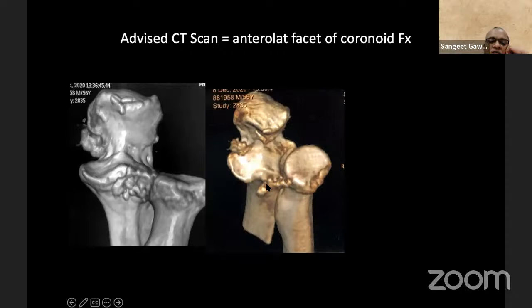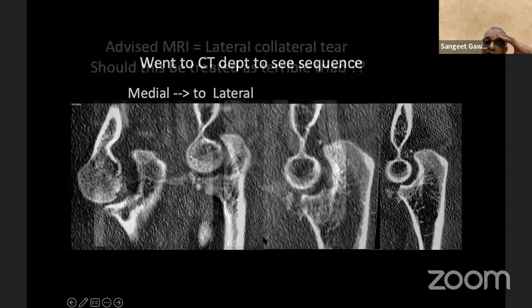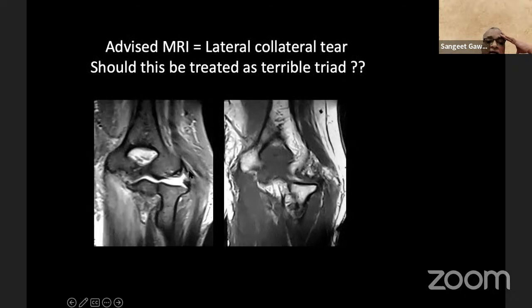So these small fragments should not be missed. Whenever you have them, please do a CT scan. It will reveal much more information. So this was again probably an elbow dislocation which got reduced by itself. And that is his picture where you can see the coronoid process, which is a very small fragment, which is not fixable. And then on the lateral side, you see fluid in the lateral collateral ligament, which represents a collateral tear.